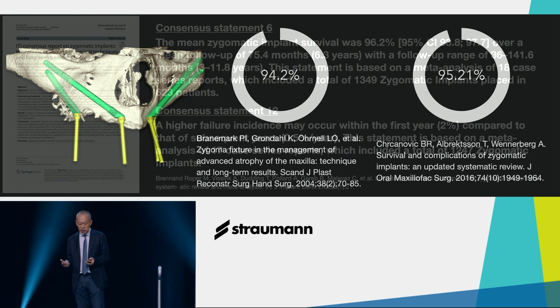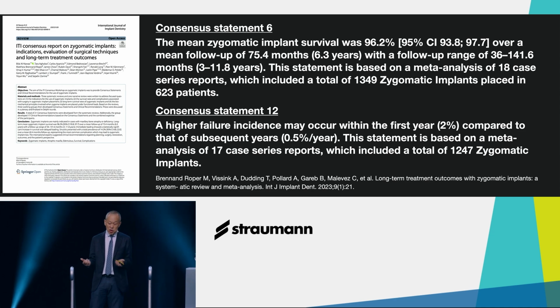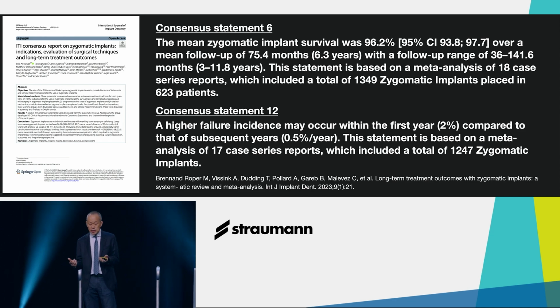And Edmund mentioned the ITI zygoma consensus. And we can see in this consensus report, the mean zygomatic implant survival was high, over 96%, with a mean follow-up of over 6 years.